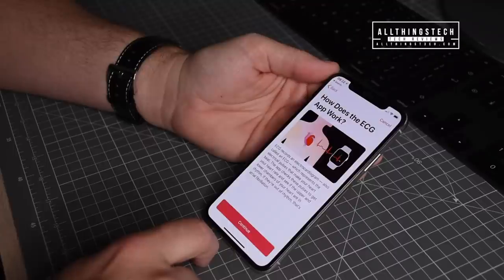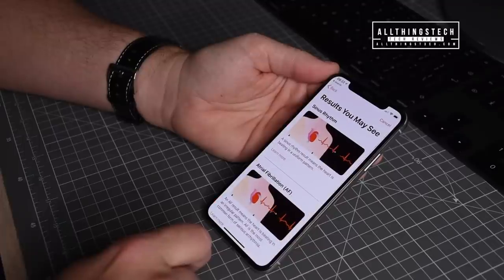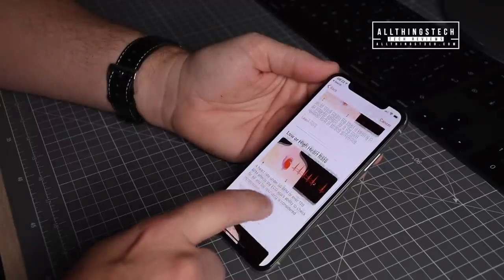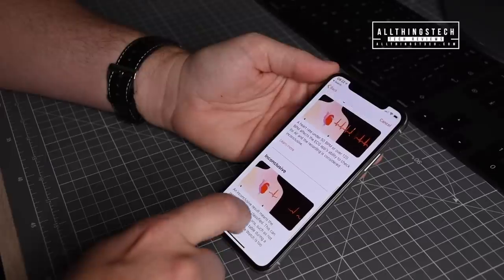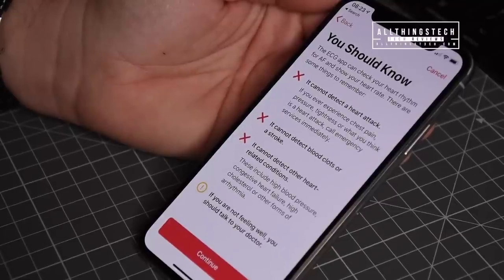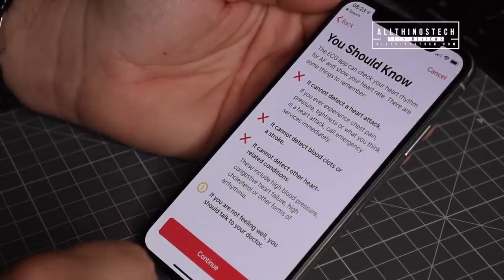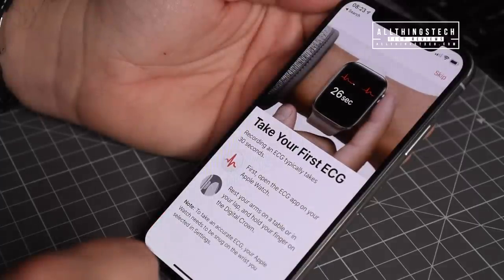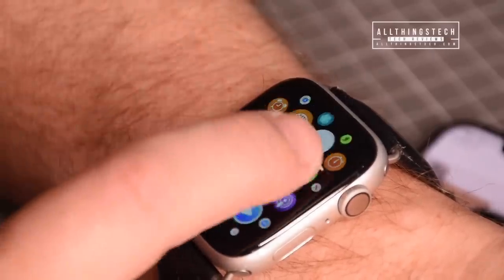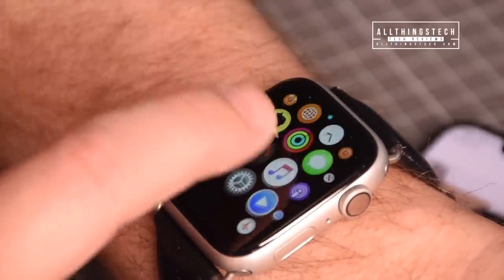You'll then need to read through the setup screens — it's quite important that you do, because they explain exactly what the ECG does and doesn't do. It will tell you about the results, what you can learn from them, and what you can't rely on. For instance, it won't tell you if you're having a heart attack. Once you're familiar with all that, click Continue and you'll be prompted that you're ready to take your first ECG.